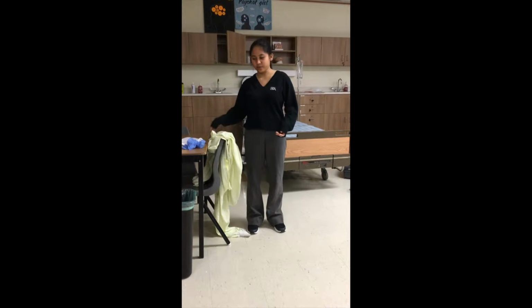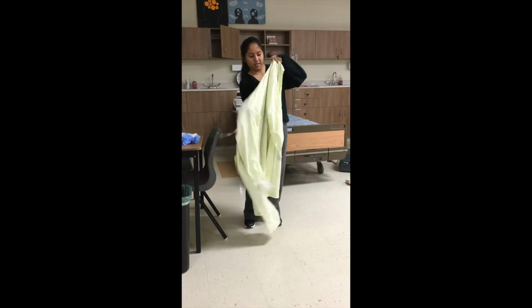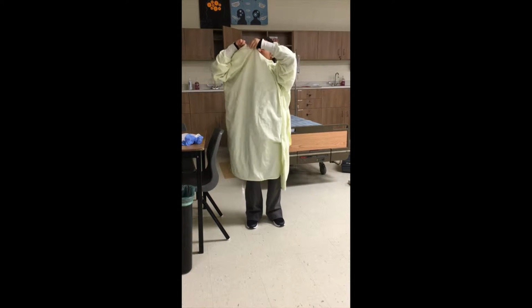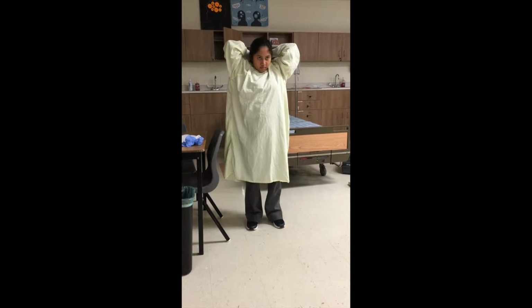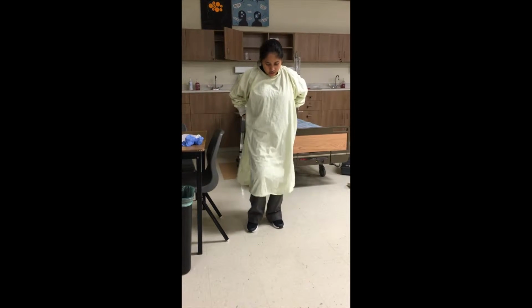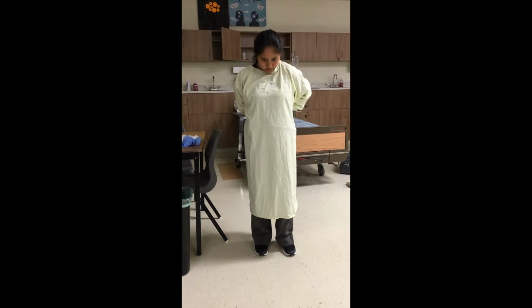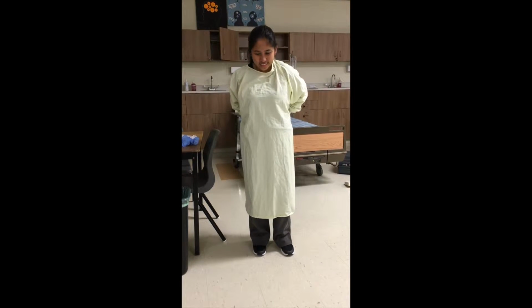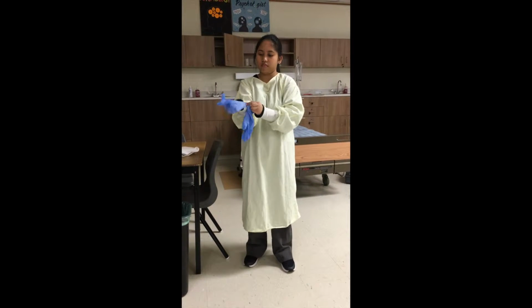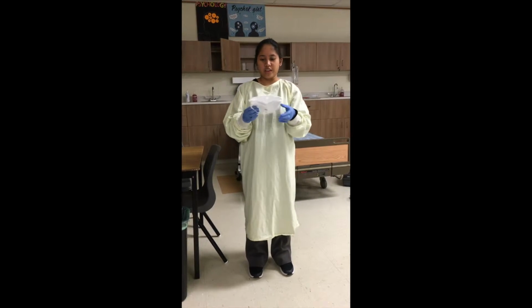Here for an airborne interaction with a patient, you just need to put on your gown first. So just tie it at the back. And over here. Also make sure that the hair is tied back. And then put on our gloves. And for airborne, we wear N95 masks.